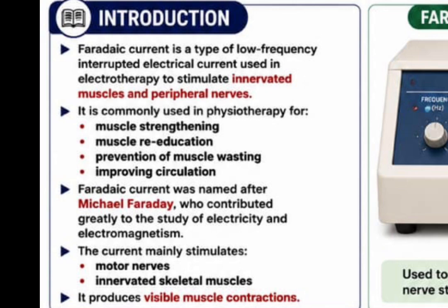Key point, always remember that the Faradic current is a type of low frequency current, because I told you there are low frequency, medium frequency, and high frequency currents. Electrotherapy is using electricity to provide therapy to patients, to promote healing, reduce pain, increase joint movement, muscle strength and mobility. It is common in physiotherapy for muscle strengthening.